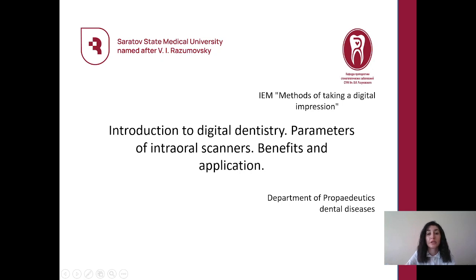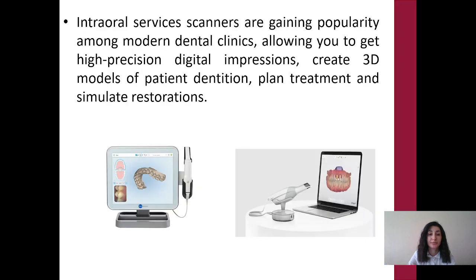Welcome to Interactive Educational Model Methods of Taking a Digital Impression. Lecture number 1. Introduction to Digital Dentistry, Parameters of Intraoral Scanners, Benefits and Applications.